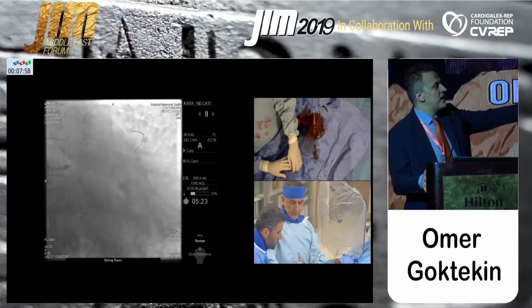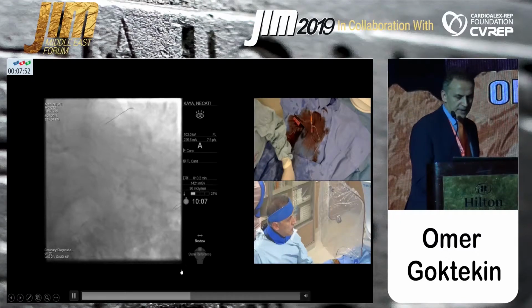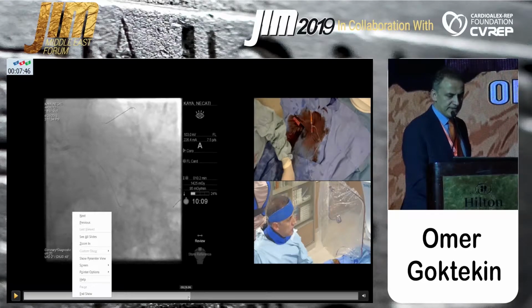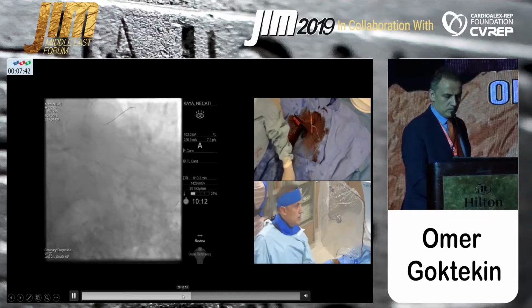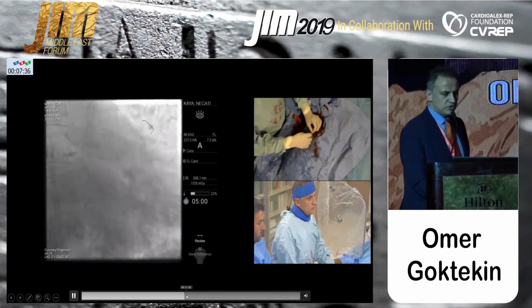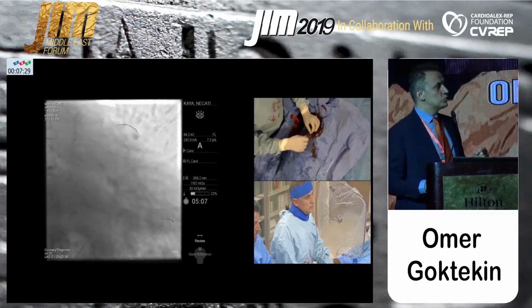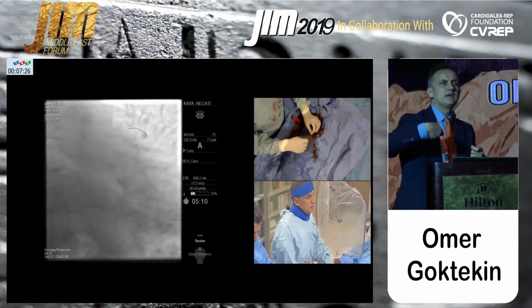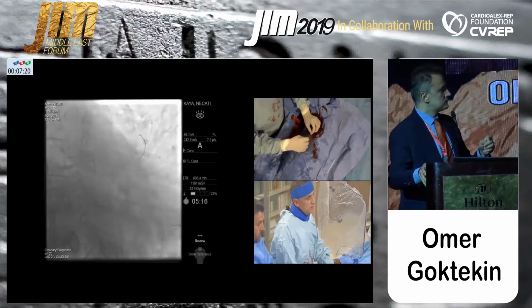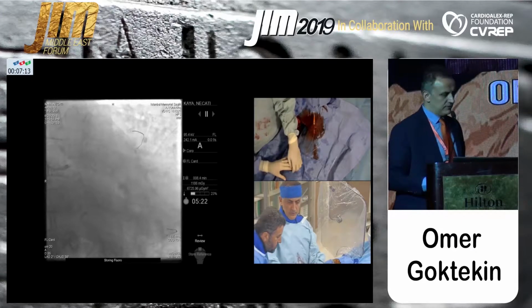So I changed the guide wire now. I insert my microcatheter and I change it. So I don't know if you see it. I can come back because I think it's important, because what Dr. Colombo said is very important. Okay, now I'm inserting the microcatheter with trapping. To insert the microcatheter, I have to trap the wire. Otherwise, the wire will go and we can lose everything. So we have to trap the wire when we send anything over the wire. And now you see the microcatheter and we will change it.